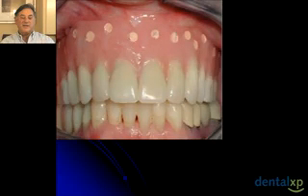My colleague on this case got a little bit carried away with the gutta-percha marks, but they beautifully demonstrate you want a number 2 round burr, gutta-percha to approximately 0.5 millimeter in depth. You want the gutta-percha in a spherical way, and you do not want any material other than gutta-percha. Try not to use stainless steel BBs or other barium markers or other material. The software knows to look for gutta-percha in the marking.